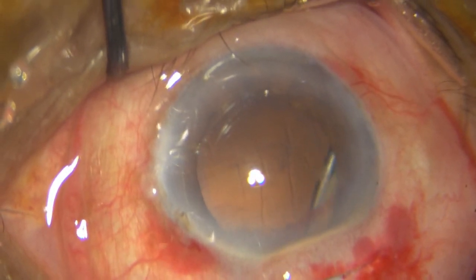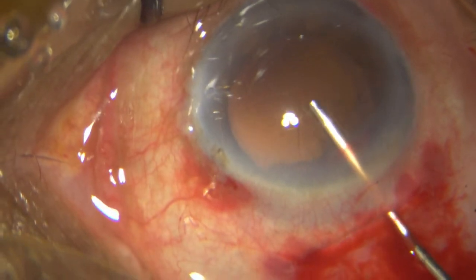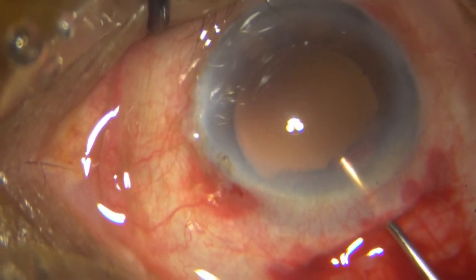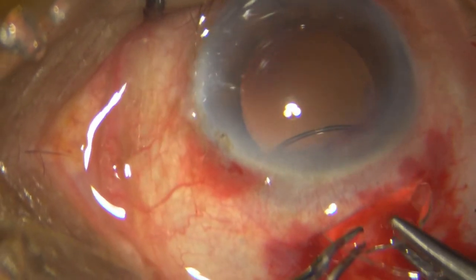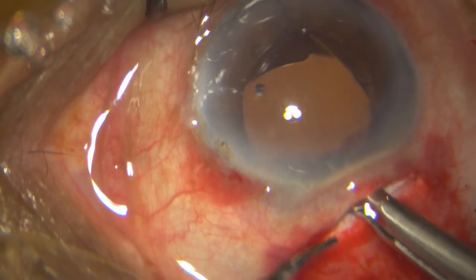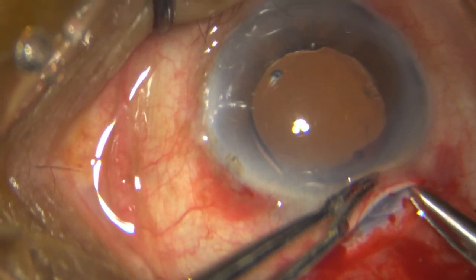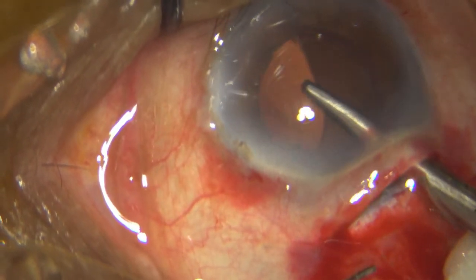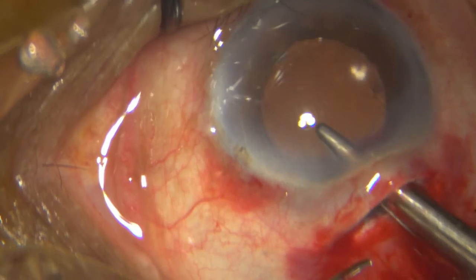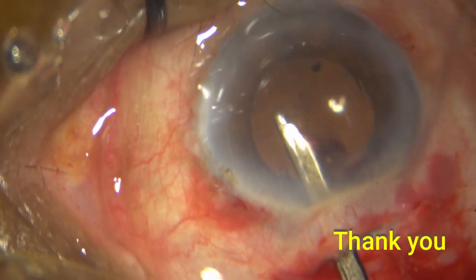Once all the cortex is out, I put in some HPMC and it is time to implant my single piece rigid PMMA lens. Just making sure that to whatever extent it goes into the bag, I tuck it into place, remove all the HPMC, put in my intracameral antibiotic, hydrate the side port, and conclude my surgery.